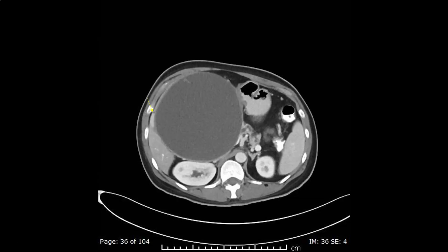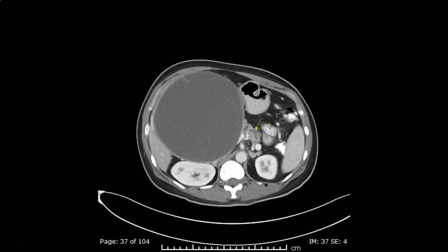Here we see a very important anatomical landmark. This is the second part of the duodenum, identified by its content of contrast agent and a small gas bubble pointed to by the yellow arrow. This is the rest of the pancreatic body with dilatation of the pancreatic duct.